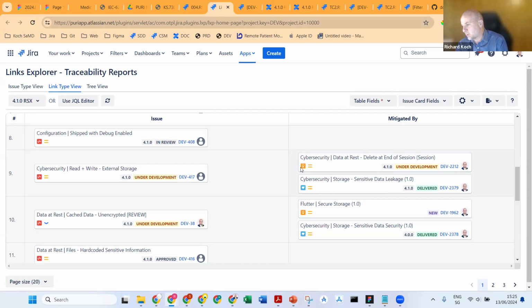And again, we have one from the product requirement. We have one from the specification. Now, you could have one for your detailed design as well if you wanted to, and I think that could be a good idea. But also, given that the specification is implemented by the design, if you're verifying the design, by default, you're verifying the specification as well. So, I think it's really a risk class issue on how to do it.